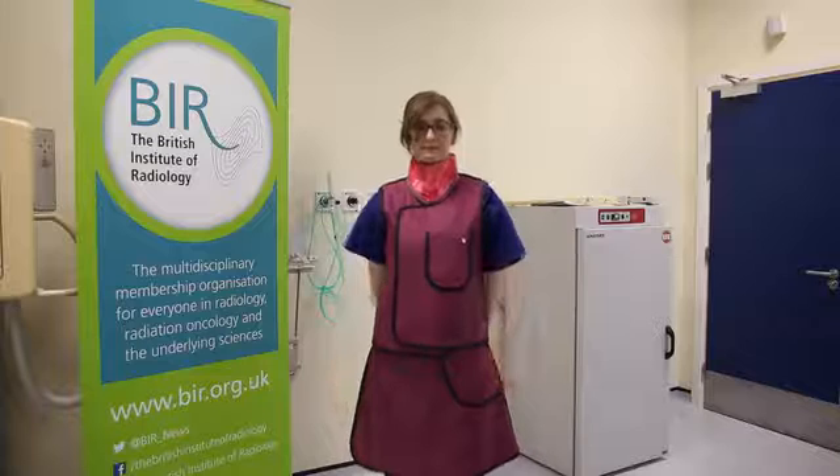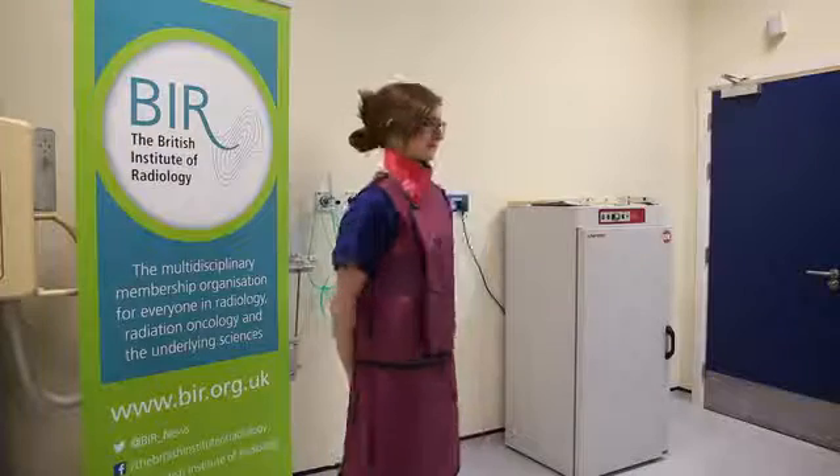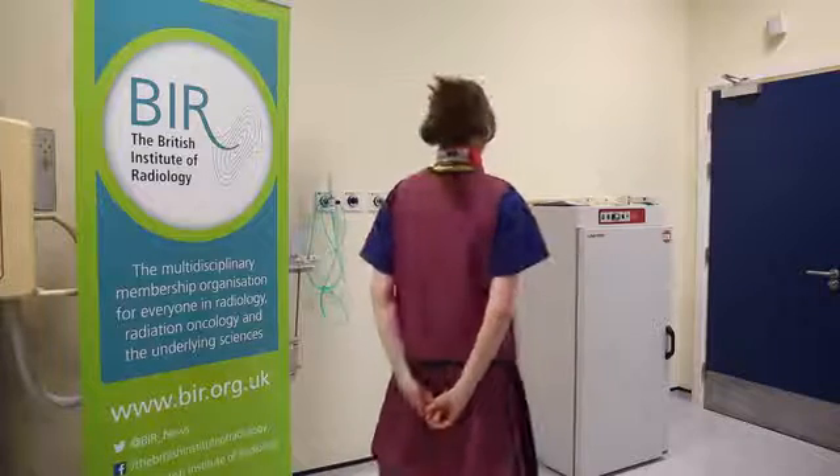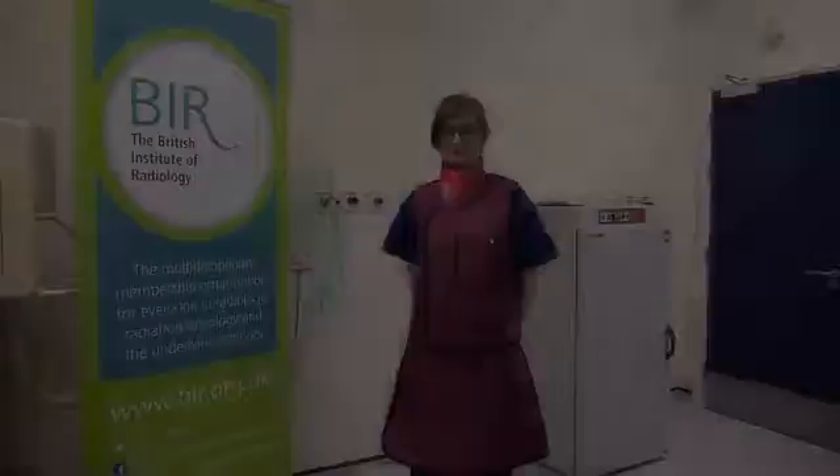Now that the PPE is on, you can see the front is straight. It fits nicely under the arms and the top overlaps the kilt. Remember, it's not only patient safety that counts. Give yourself the best radiation protection you can. Thank you.